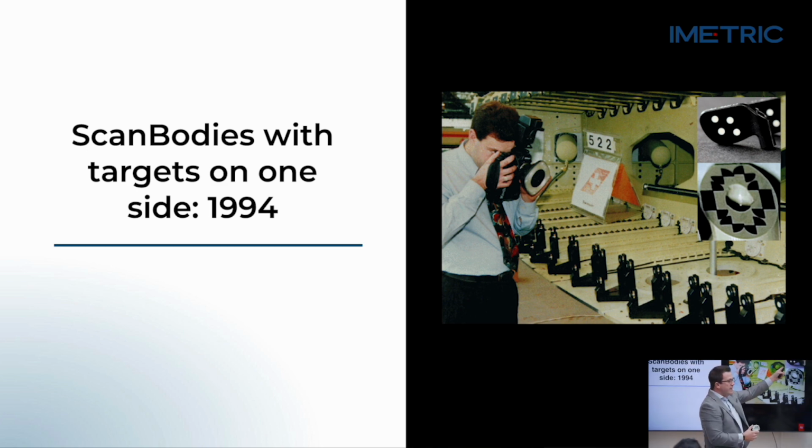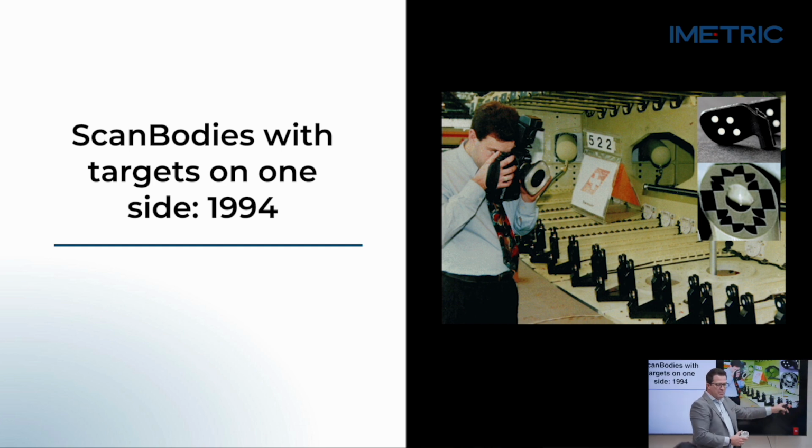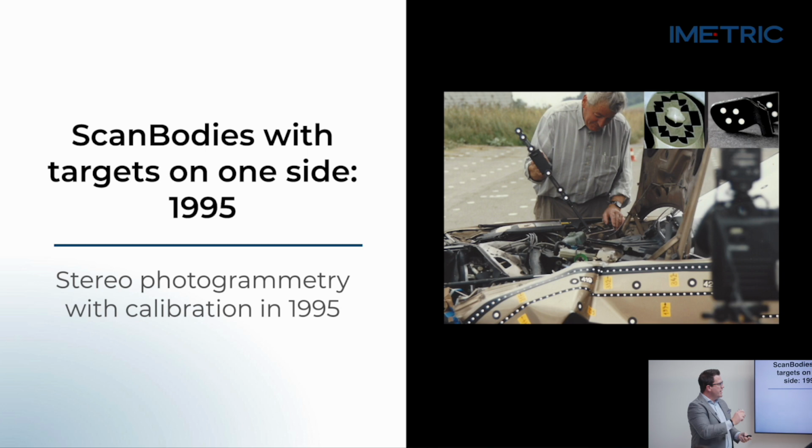Up here, this is a PIC. Everyone heard of the PIC photogrammetry unit? This is from the micron mapper. They essentially have a flat surface when you're scanning. The challenge with that when you're scanning implants is, if you're scanning a single flat surface, how does the software know if the implant's leaning forwards or leaning backwards, right? With the ICam system, we're introducing multiple sides.